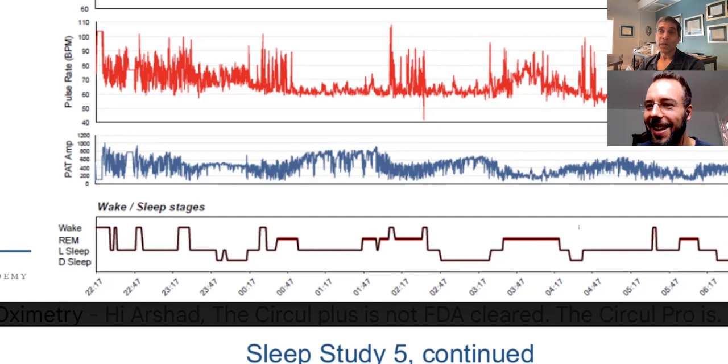Yeah, you nailed it. The number one reason why people pursue treatment is to feel better. And the number one reason why they continue, for instance, CPAP, is it makes them feel better. But it's tough when someone has pretty bad apnea with significant hypoxia and they feel fine. And you're seeing it right in front of you. Someone with more significant apnea is physiologically experiencing fewer awakenings. So it's complex. Why? I don't think they've ever looked at it. There's so many questions. The ratio of what we know to what we don't know is always close to zero.